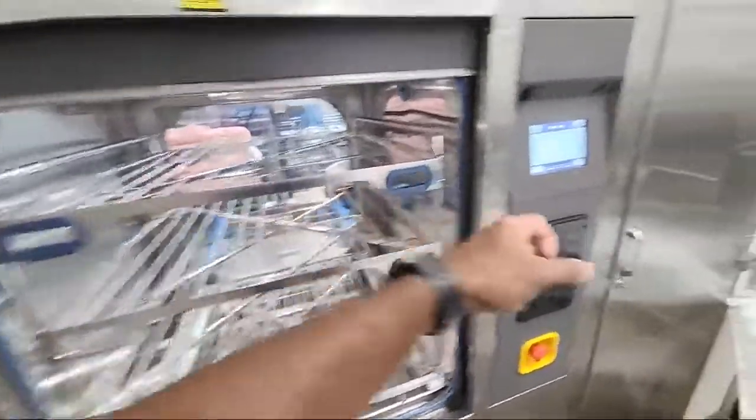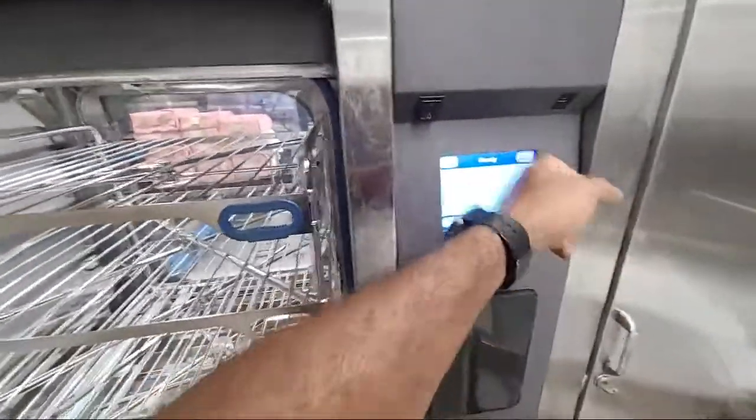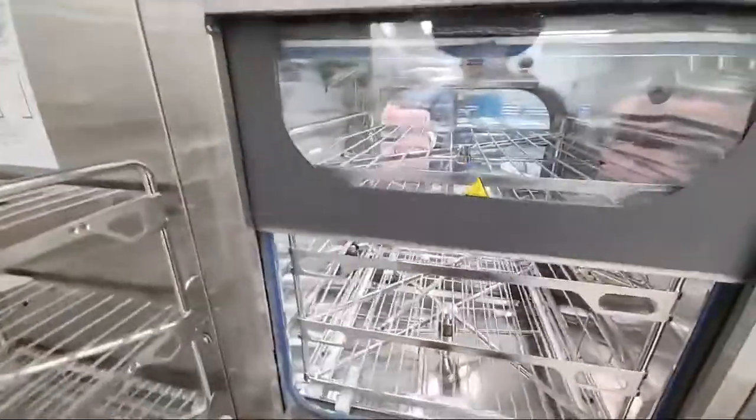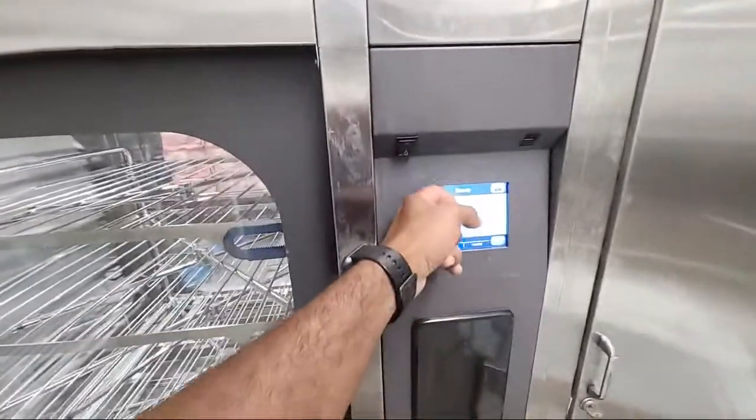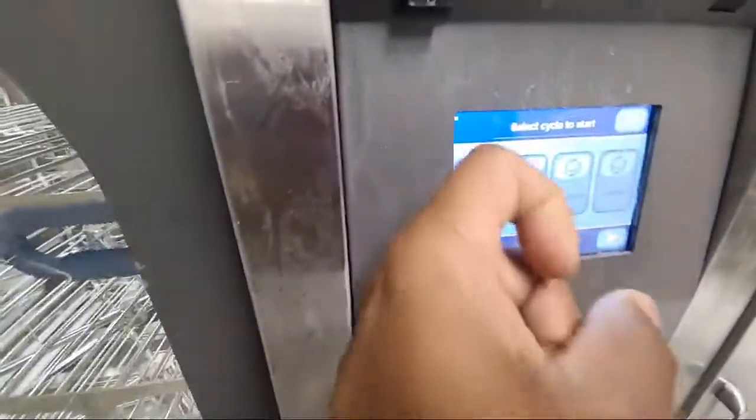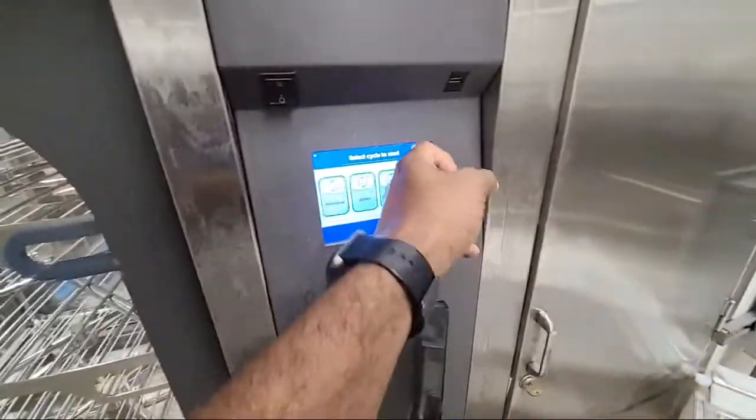And then we close it down. We run it on the instrument cycle. And remember, these 2 doors do not stay open together. So one's closed, one's open at all times. Or they're both closed, obviously, when it's running. So there we have a setting for instrument. So we're not going to run it. There's nothing in there. And there's an extra card over there.